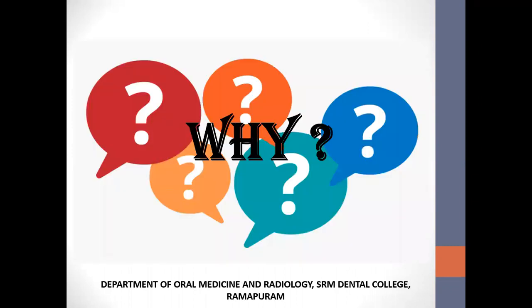So why do we need to know anatomical landmarks in the first place? The radiographic recognition of a disease requires a sound knowledge of the radiographic appearance of normal structures. A proper diagnosis mandates an appreciation of the wide range of variation in the appearance of normal anatomical structures. So basically, to know what is abnormal, first we have to know what is normal.